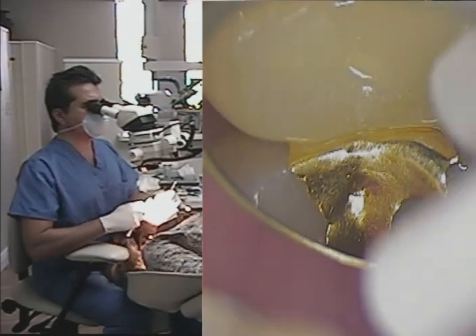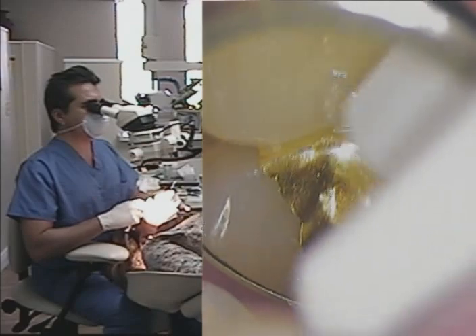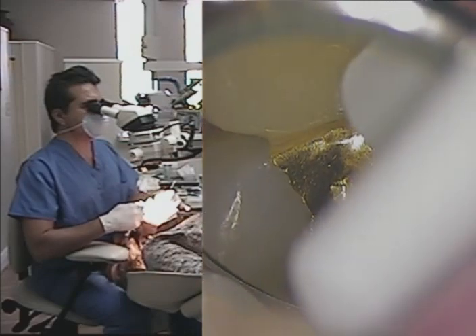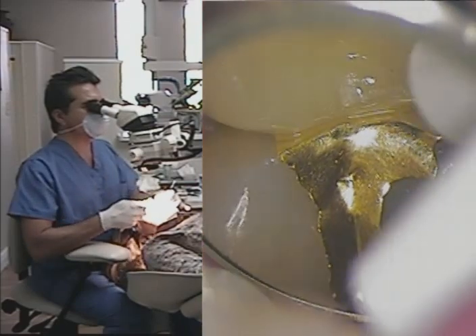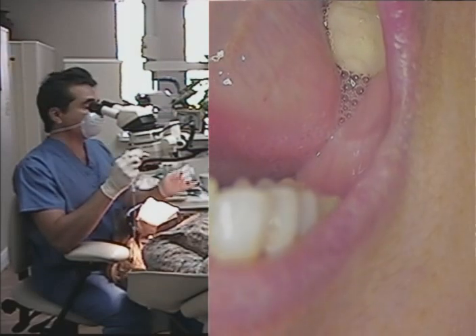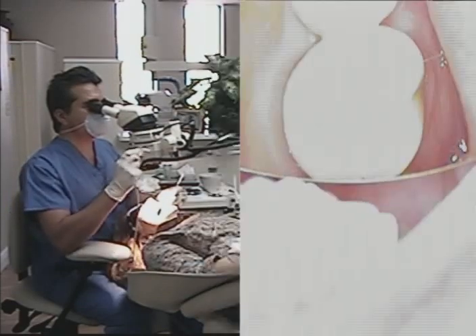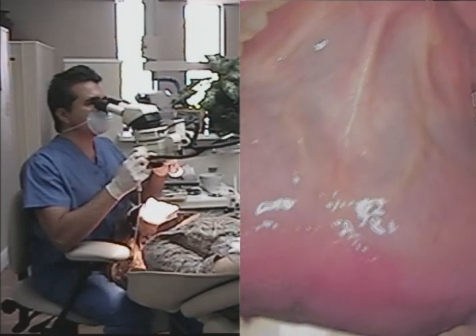Basically what I'm trying to do is make sure I stay in focus for you guys out there. I'm taking a look at the 13-inch color monitor attached to the dental chair. We're giving you not only live feed off the video camera inside the microscope, but it's also being fed to two other places: one goes to my computer and the other goes to this chair-mounted video screen. We have the ability to record data from the patient's mouth right into the computer, into the database, right along with the x-rays. We also mount the microscope photographs in their own display mounts, similar to a full series of x-rays.